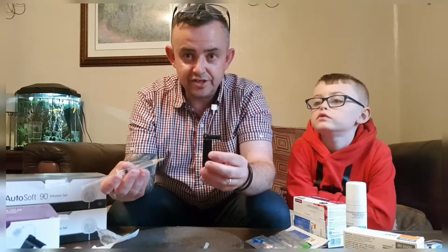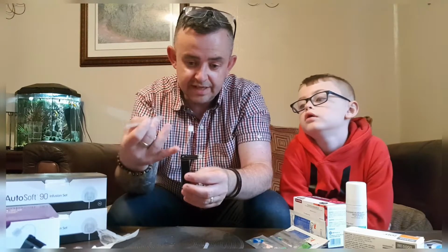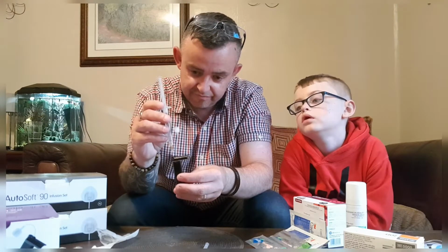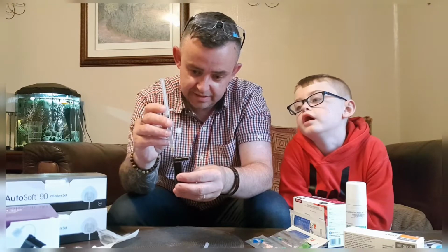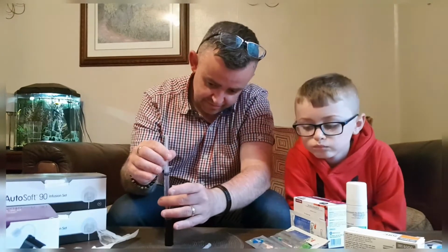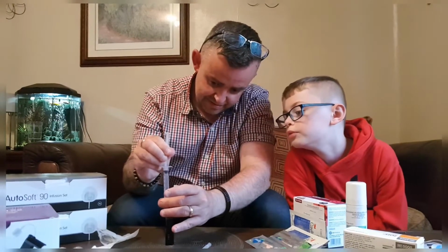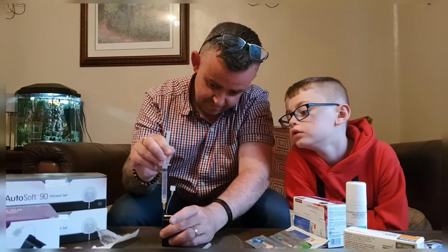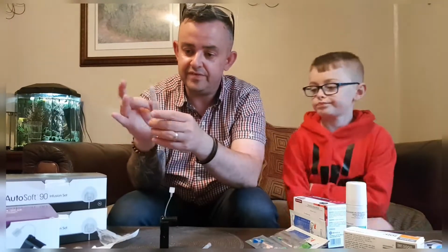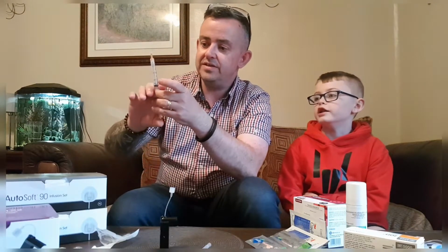So we get the cartridge. What we need to do then is take the air out of this cartridge, because there's already air in there. How? So we pop that in there, put that flat, and then pull out. You'll see the air bubbles. So that means that's now got no air in it. And then we just flick the air out of that, and then you just squeeze it.